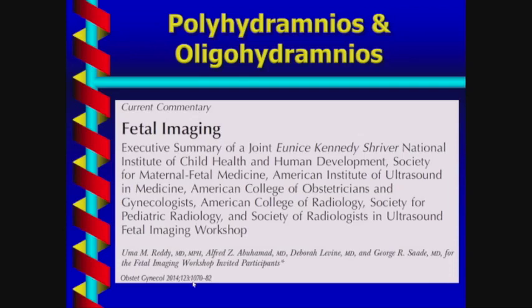Another use of measurements, not fetal ones, in ultrasound is in the assessment of poly and oligohydramnios. Here, the recommendations that I'll talk about come from a multi-society panel from a few years ago that came out with its final recommendations in this paper that was simultaneously published in 3 journals. And again, multiple societies were involved in this. I was one of the panelists on it, as are some of the other speakers at this meeting.